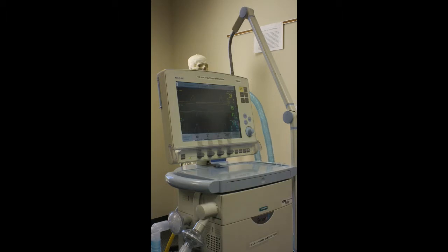That's true, it will change it. I'm just saying that it will change it. There's an actual setting to set the rise time. Can you guys see that? Sorry. Okay. Yeah, got it. So rise time is also called slope, ramp, slope, P ramp, I think, and then rise time percent. When you're on different ventilators, it's going to have different names. But it's all the rise time, and it all has to do with how quickly we get to that set pressure.